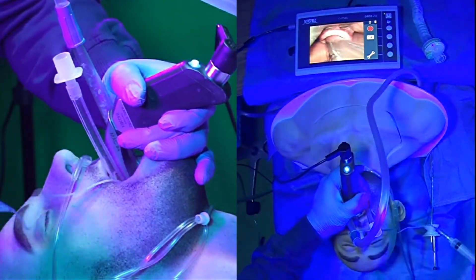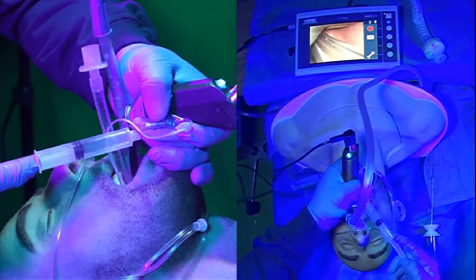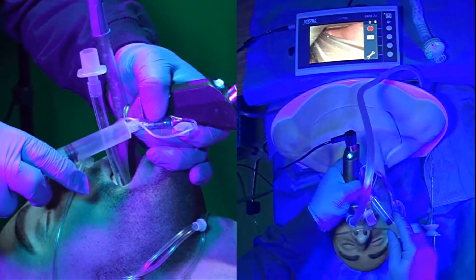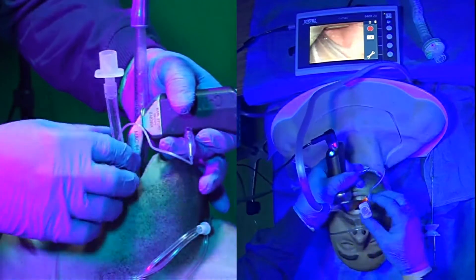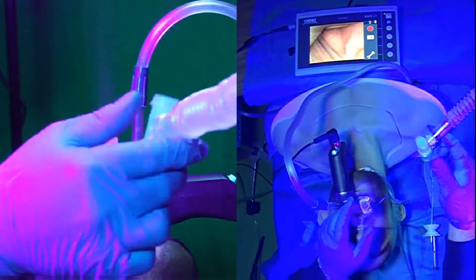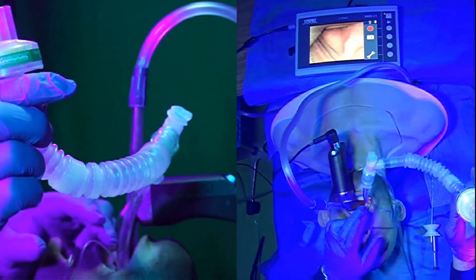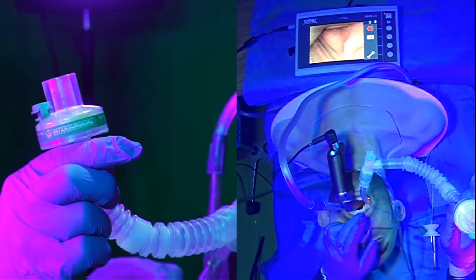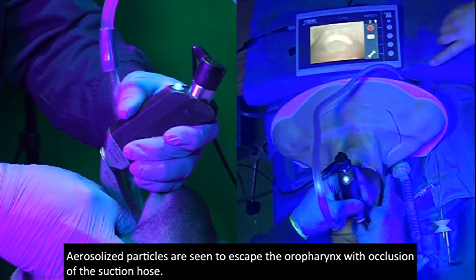So the tube is in, we're going to flare it up and turn the suction flow.